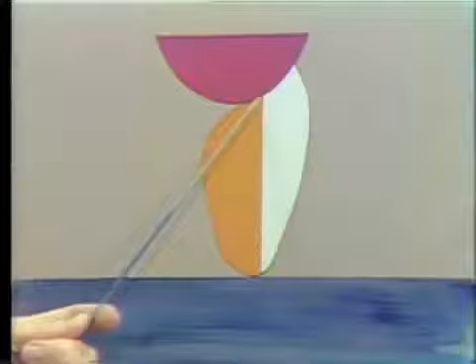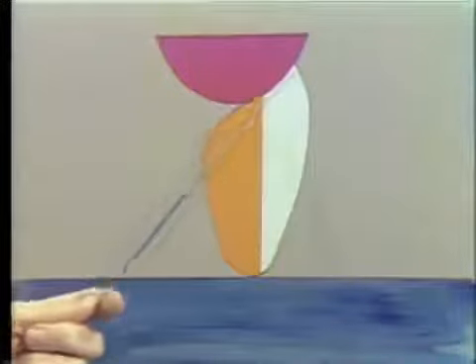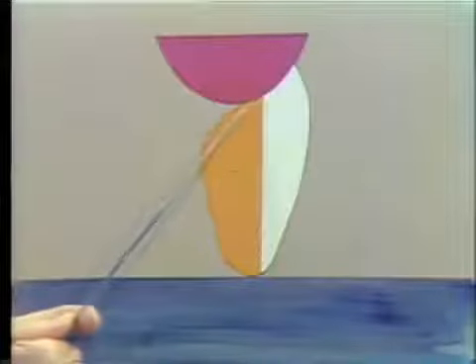This is an important thing to recognize. It's very easy to see it here in an enlarged diagram. It's not quite so easy to achieve in the smaller situation in the mouth, but is quite critical. Another aspect which is important is in the finishing of the cervical end here, that part of the pontic which fits against the mucosa in this ridge-lap relationship which we've got here.